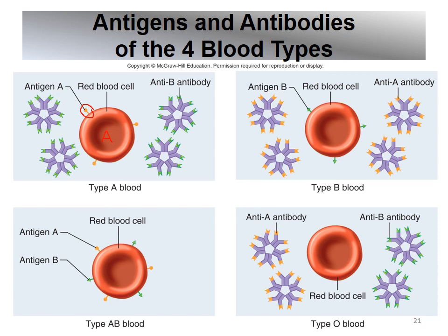what type of antigens are on my cell? A. Which antigen do I not have? I do not have B. So which antibody is in my plasma? It would be anti-B antibodies.